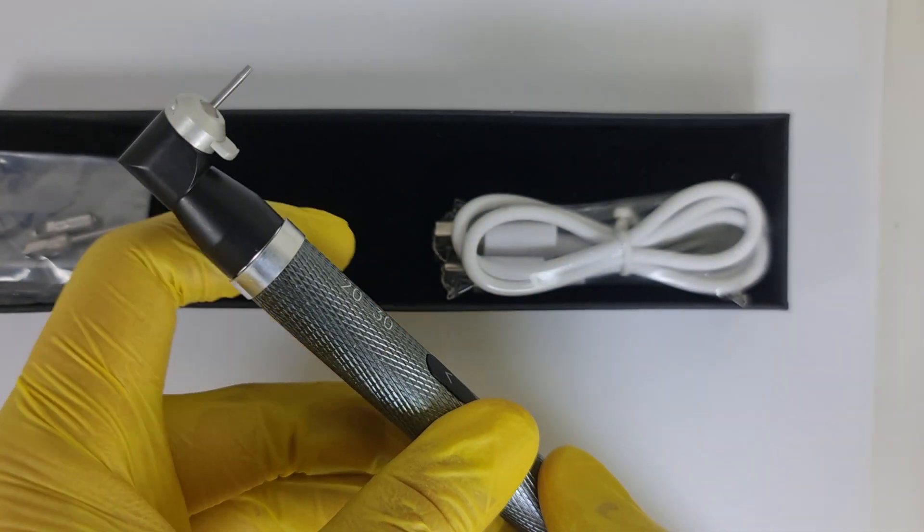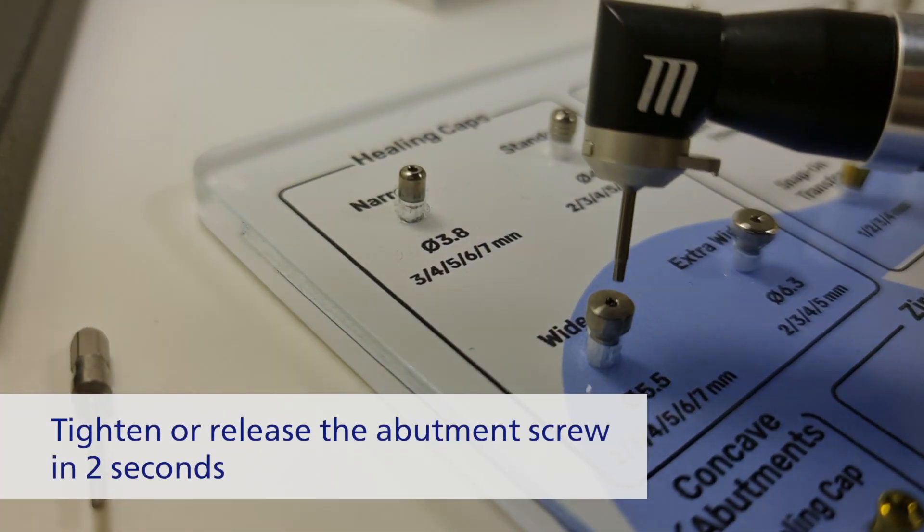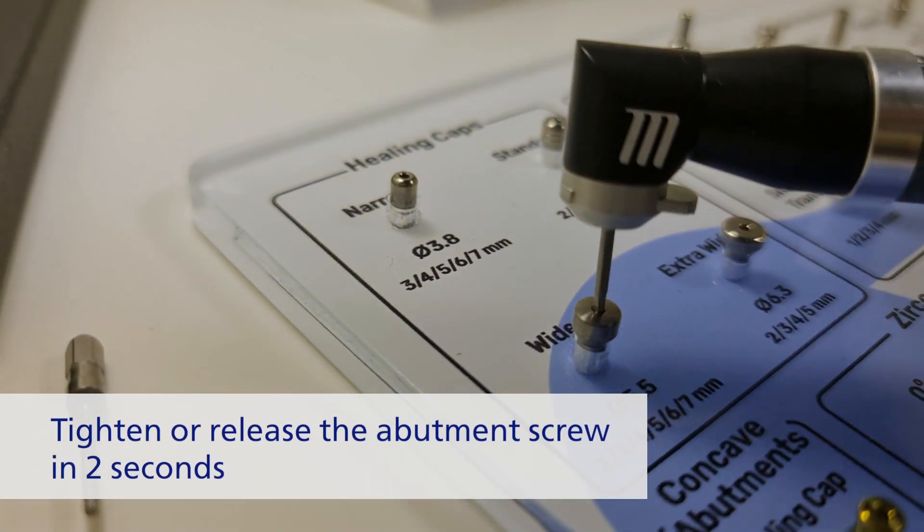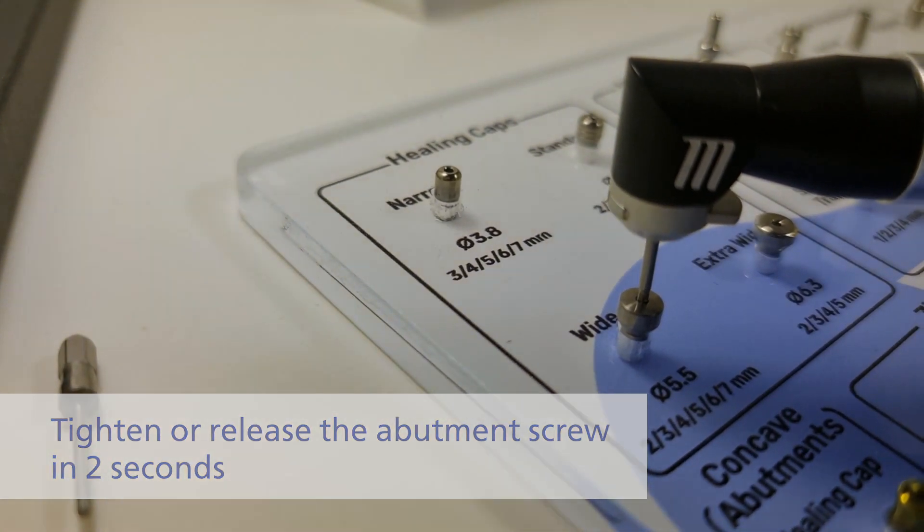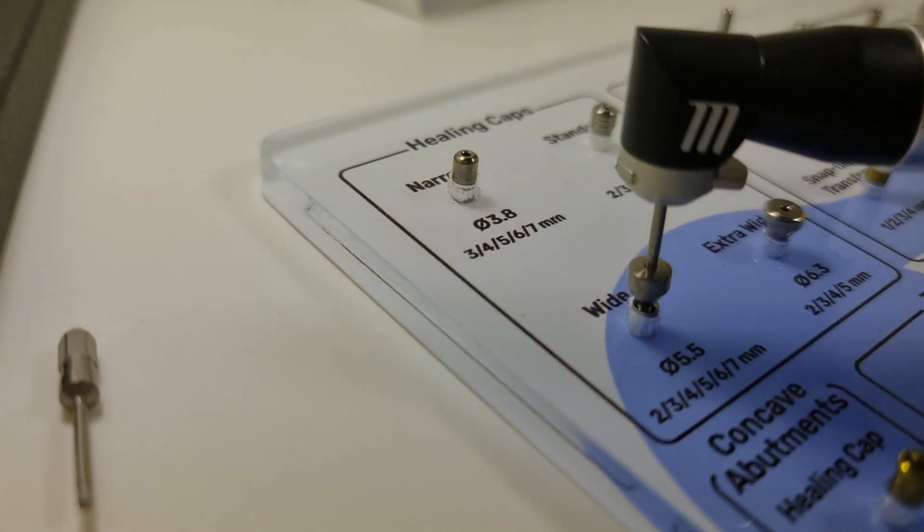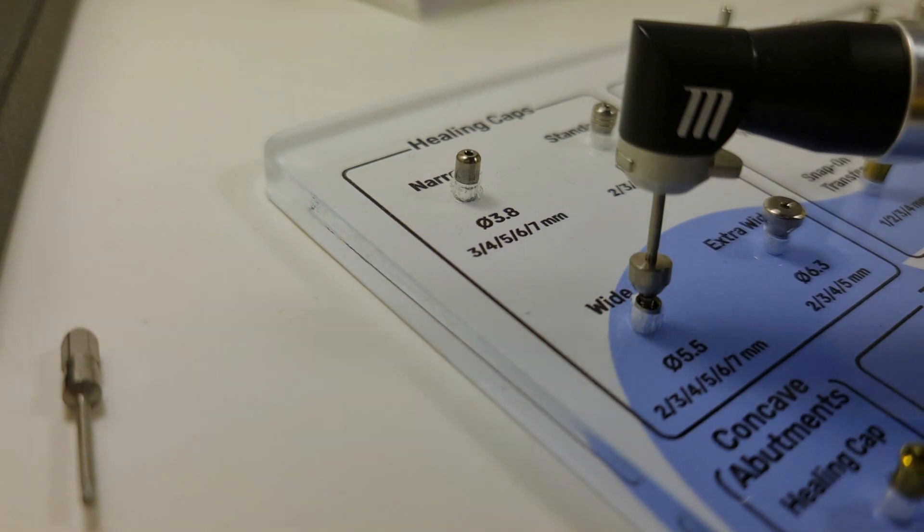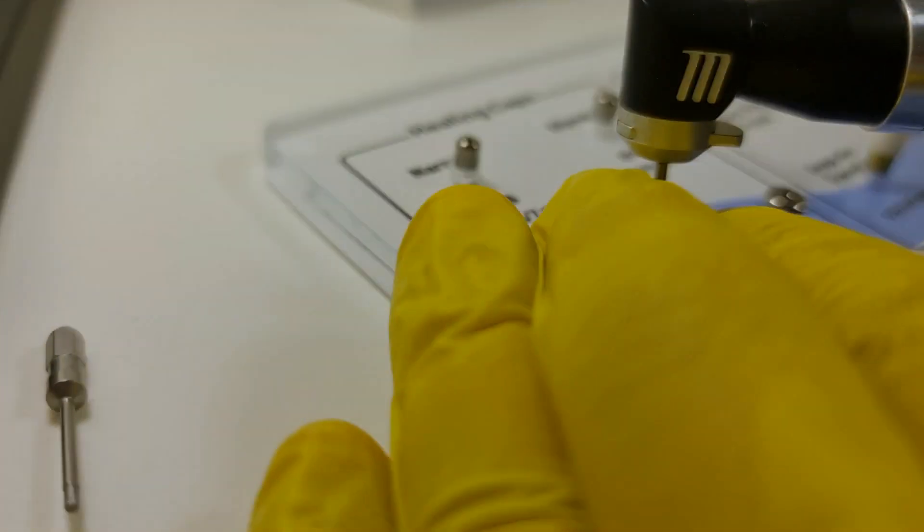Now let's see it in action. It takes less than two seconds to unscrew the healing cap. As you can see, it also provides enough grip to hold the part in place.